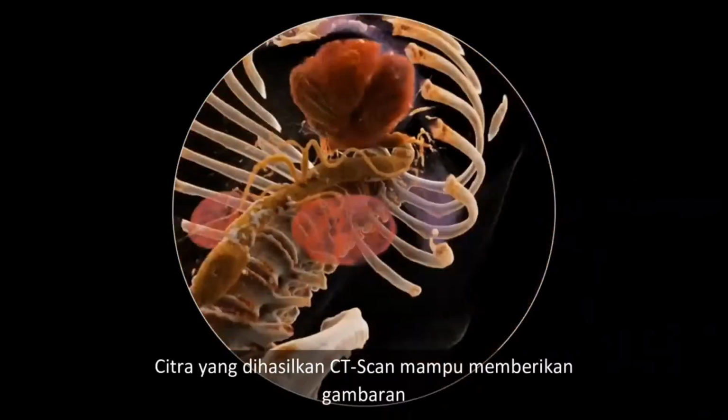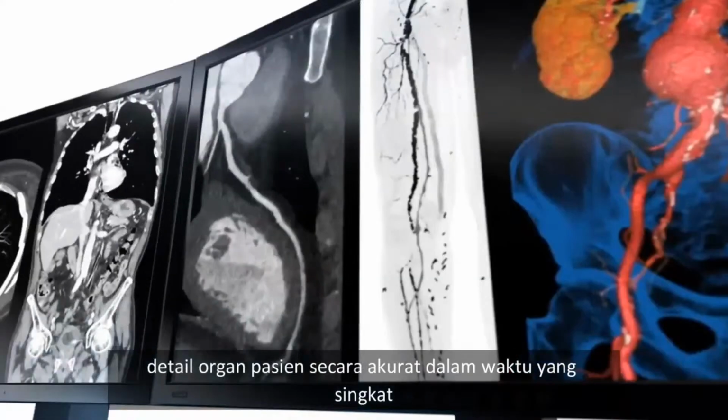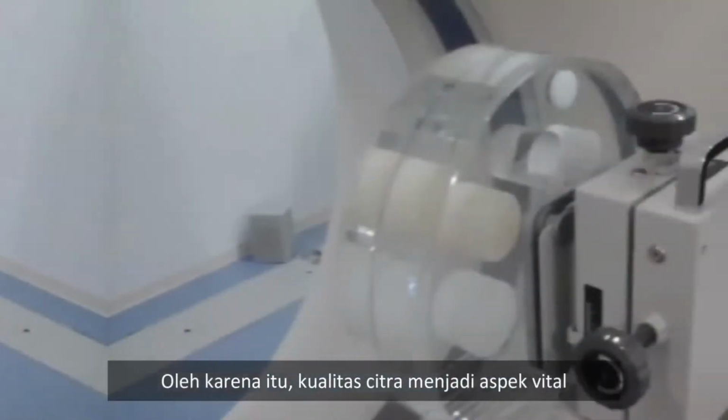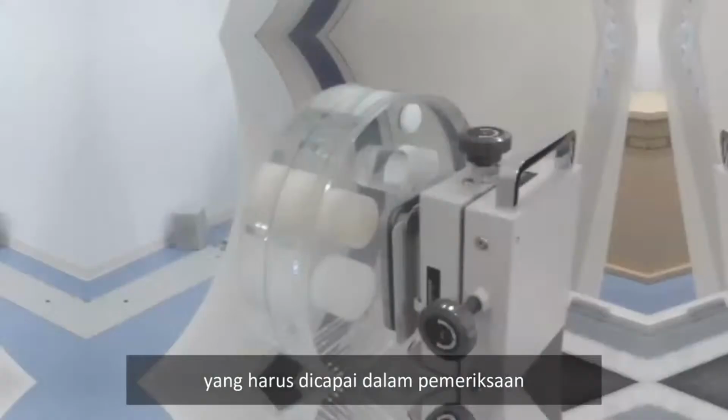Images produced by CT are able to provide an accurate detailed look at the patient's organs in a short time, supporting accurate diagnosis. Image quality is a vital aspect that must be achieved in CT examinations.